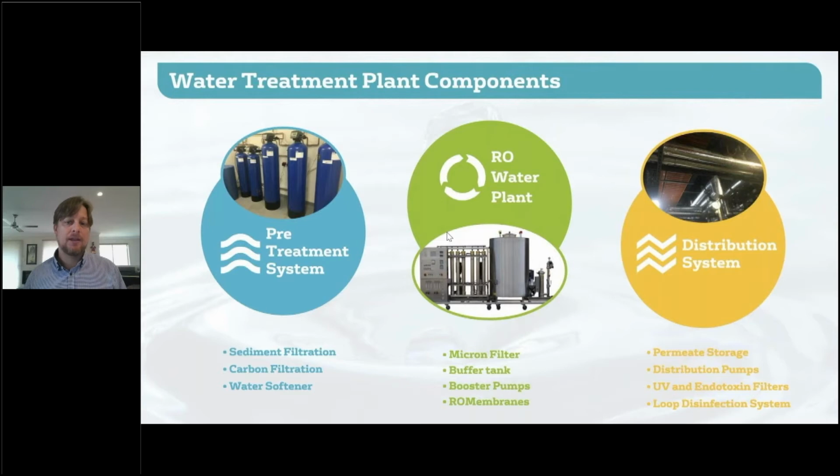So the main thing that I would like to really impress on you is that it's not just putting an RO system in. It is a multiple component solution that you need. There's 3 components, and each component is equally important.